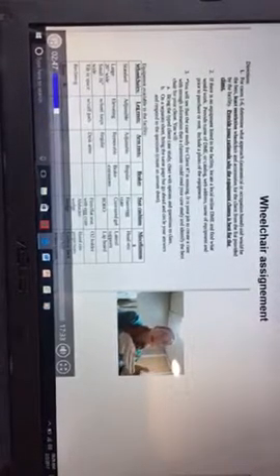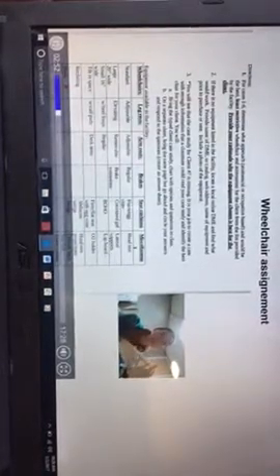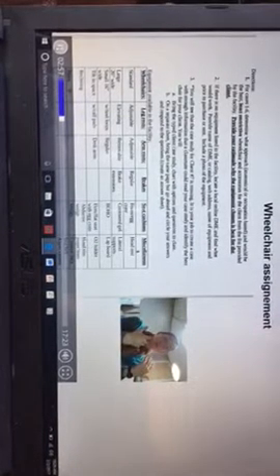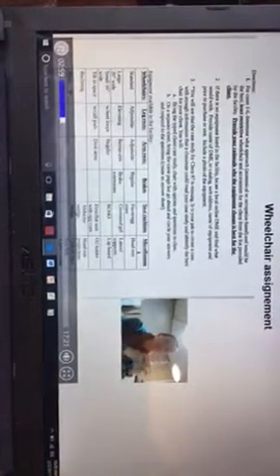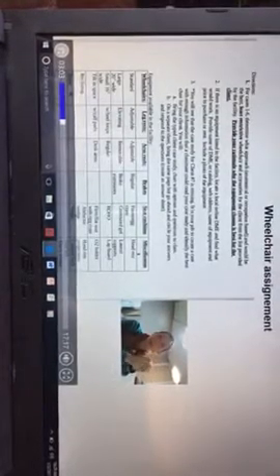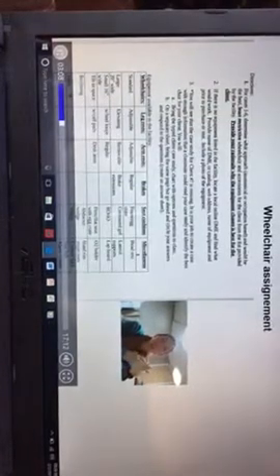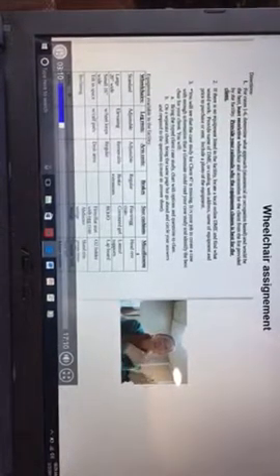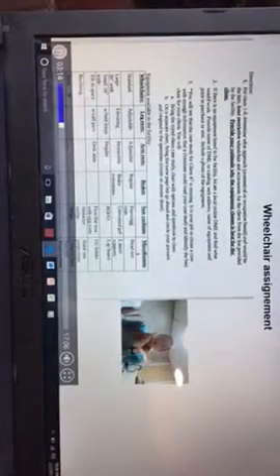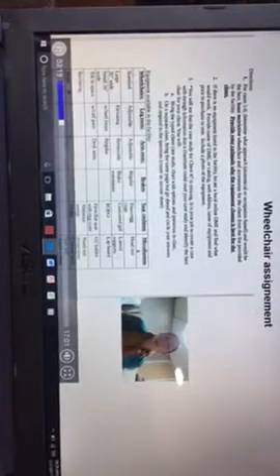A recline is going to be used more if a person has fatigue, it could be used throughout the day, but maybe if they have issues with, I guess I'm trying to think what the best option is, because depending, it might be good for comfort, contracture issues, hip, like if somebody has a broken hip and they need to make sure they're keeping up a 90-degree angle at least, then sometimes popping them back a little bit with a recline would be helpful.